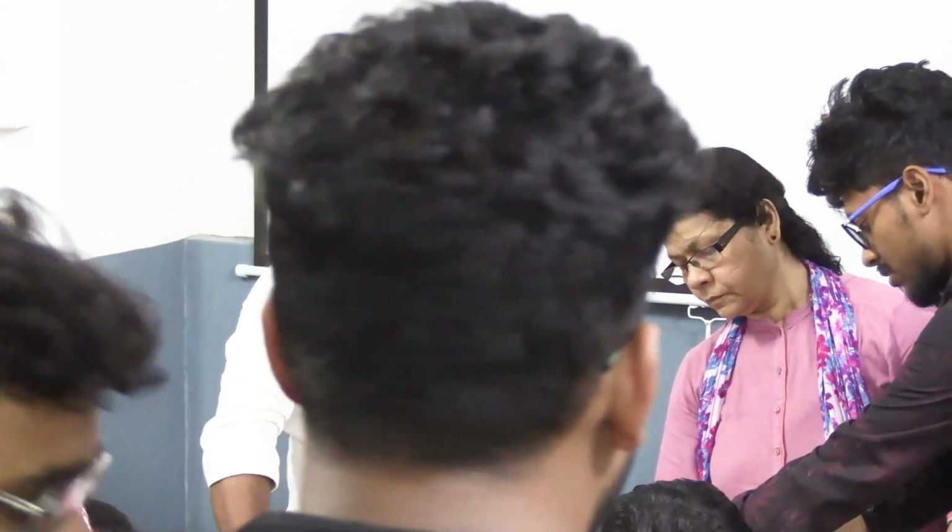ওরম না, এই এই, like this. Look at my hand. All your movements, all your scissors will come on top of your fingers. It's not going to come free. This is your guarding finger. Your guarding finger is somewhere inside here. Like this. It's inside here. Your instrument should move on top of this, always.